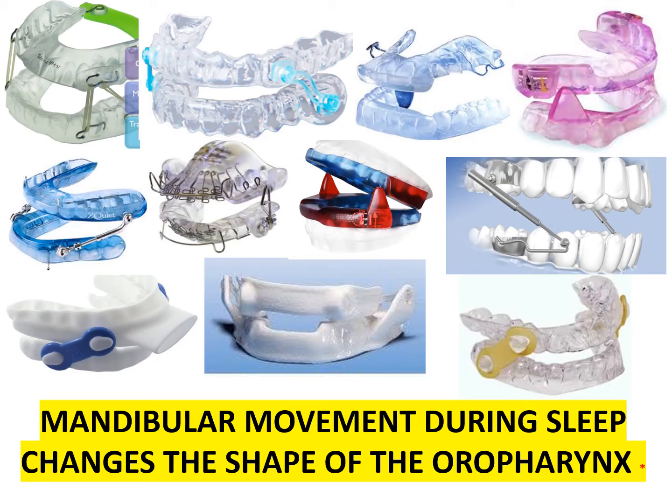Here we have a picture of many, 8, 10, 12, oral appliances that all allow mandibular movement. The clinician exercises care, skill, and effort to register an optimal, stable, maxillomandibular position for stenting.